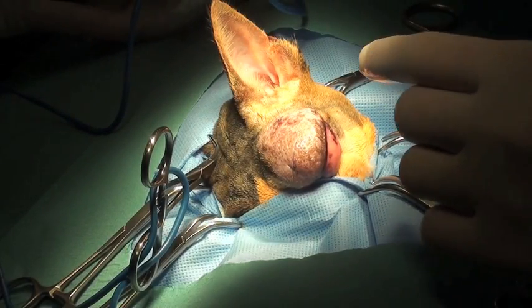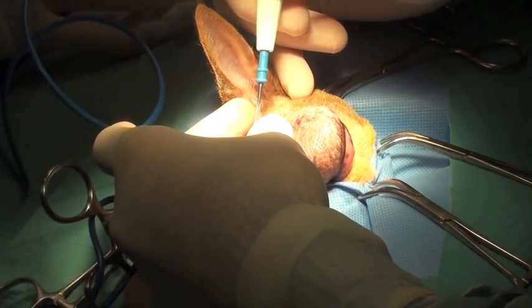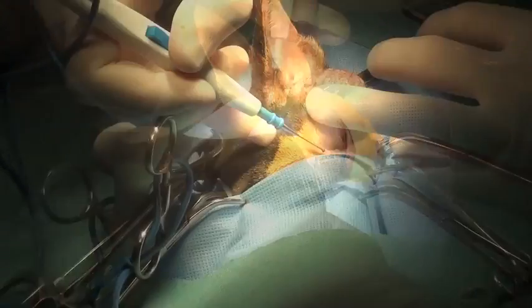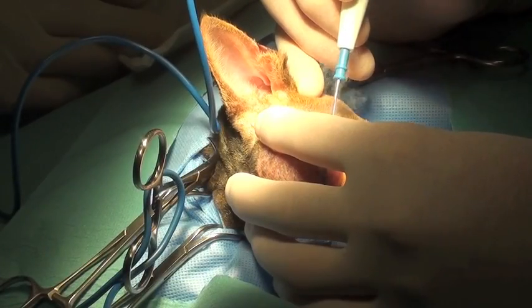The margins around the eyelid tumor are identified. Because this is a feline mast cell tumor, the margins don't have to be as aggressive as with a canine mast cell tumor.